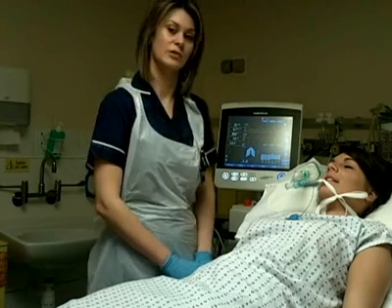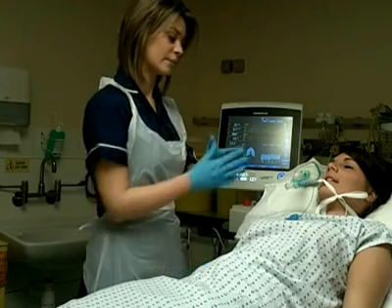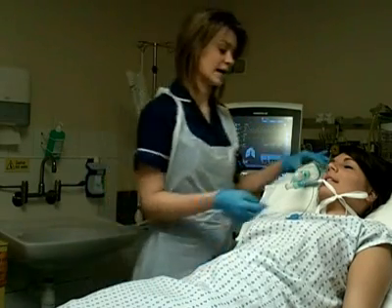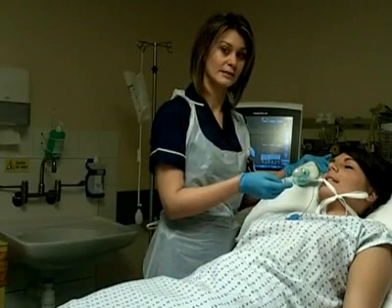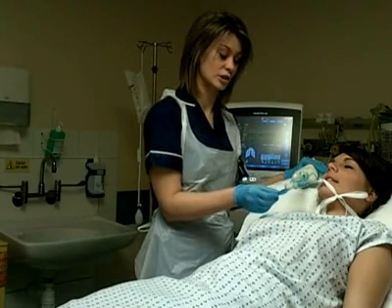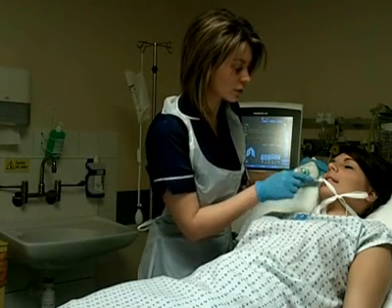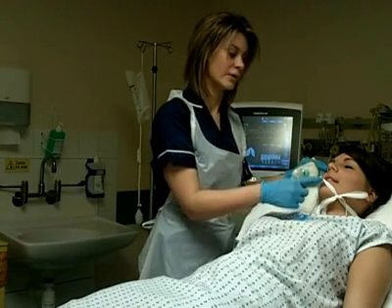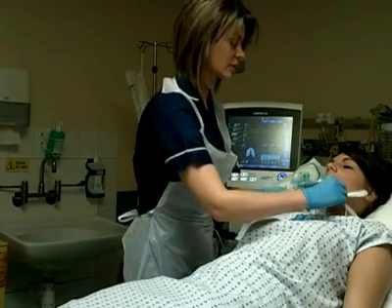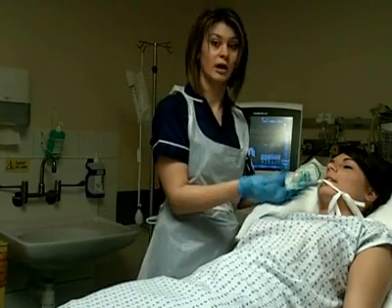Starting with a respiratory assessment for a ventilated patient, the first thing you want to check is that your patient doesn't look distressed. We'll have a look at the airway — the patient has an ET tube in place and is ventilated. You want to check the size of that ET tube and the location at lip level, comparing it to when the patient was intubated to make sure the tube hasn't migrated. Then make sure the tapes aren't too tight, and we'll check the cuff pressure.